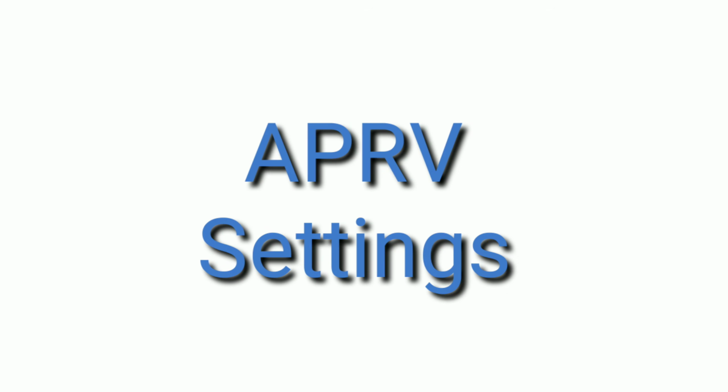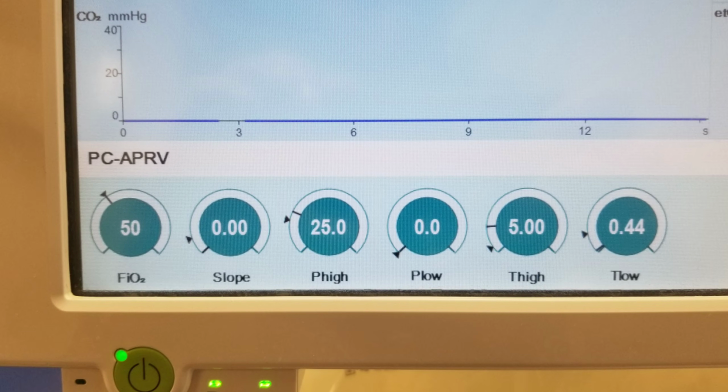So let's look at how we can set up the settings and the parameters for APRV. We have the traditional FiO2 setting, not too complicated there. We have the slope, which controls the steepness of that ramp when we go from the P low to the P high. When we're looking at the P high, I explained earlier in the lecture that this should be the CPAP, right? It's setting you into that optimal lung compliance area.